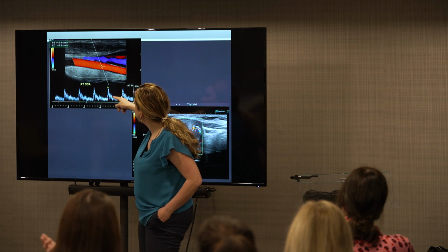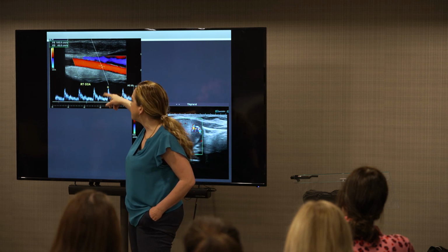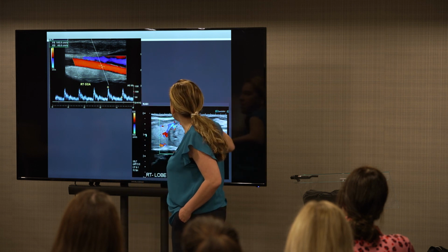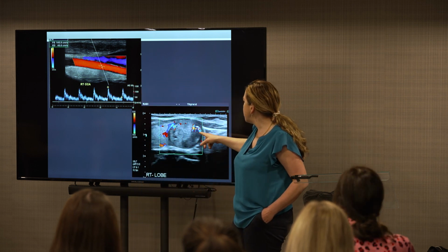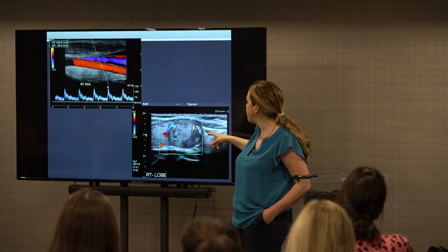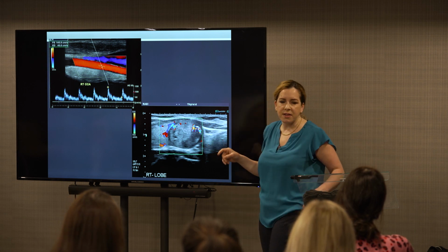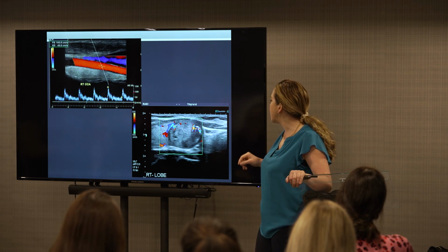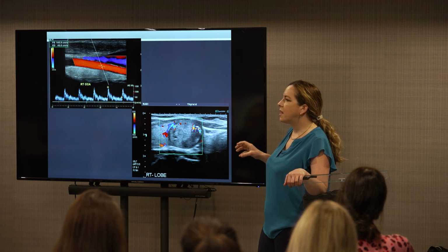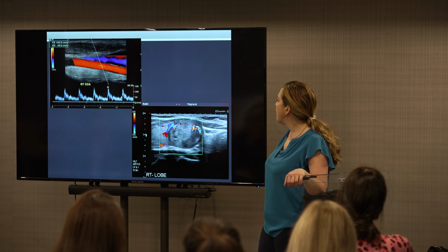You can do all sorts of fancy things, but in the context of a general neck ultrasound, you don't need to do this. That's more for vascular ultrasound. But I use it all day, every day. For every lump I see, put the colour Doppler on and see what the vascularity of the lesion I'm looking at is. And that's really important in the neck. So just everything you find that shouldn't be there, put the colour Doppler on. What does it look like?